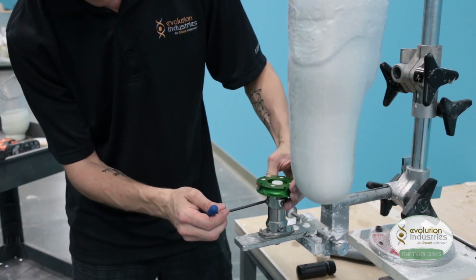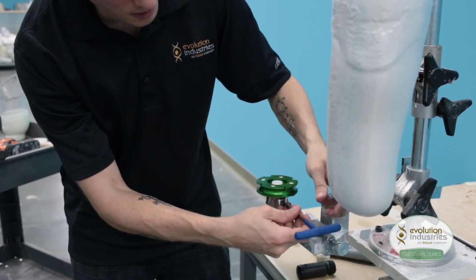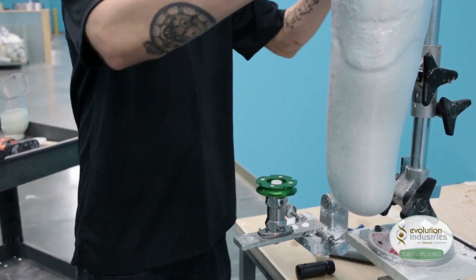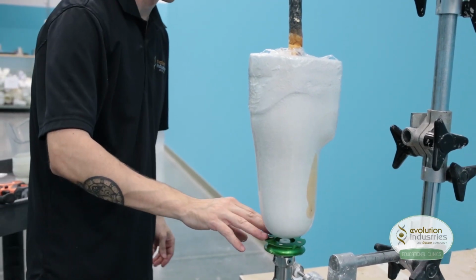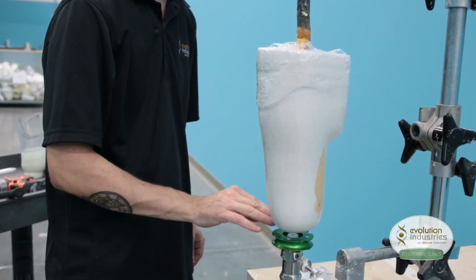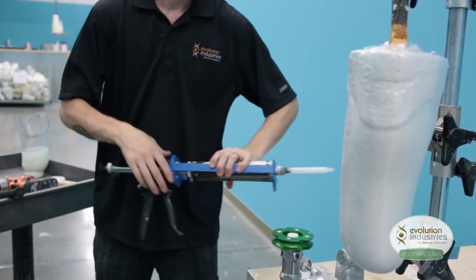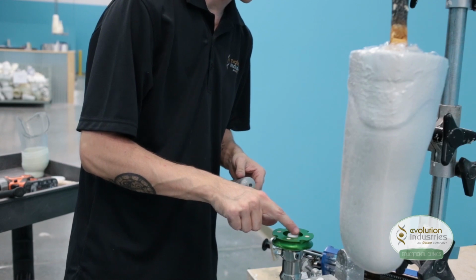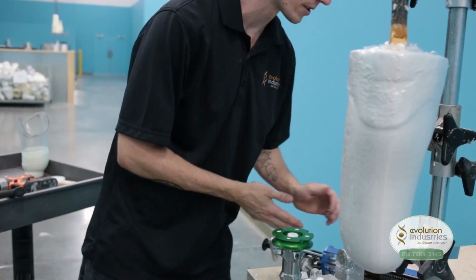We will reinsert it into the alignment jig, and because we only loosened 2 screws previously, we maintain our alignment. And before we add our Evo bond, you can double check your height. If it seems like there's more than a 1/4 inch space above the plate, that's okay, because when we did our check socket, there was a little additional thickness to the plastic, but this will maintain the height. And you want to use a little bit more of our synthetic grease and just put it on the top surface of the dummy there, and that will help it release from the Evo bond upon removal.